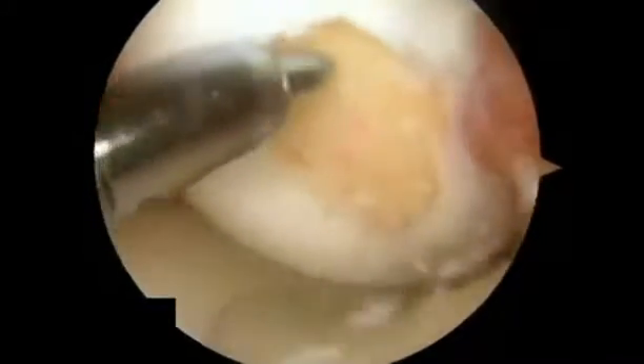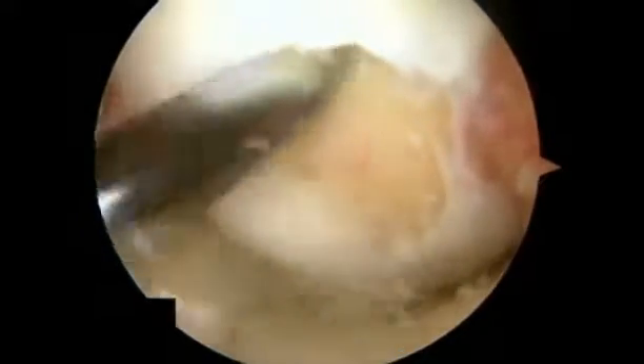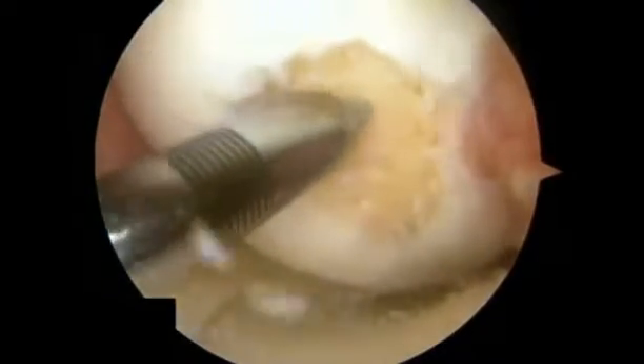Following thorough defect preparation, which is necessary for best results, the marrow stimulation procedure is performed. During this process, multiple holes are drilled throughout the entire affected area of the chondral defect.